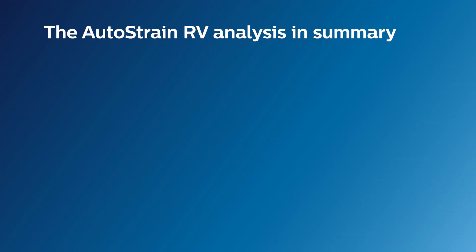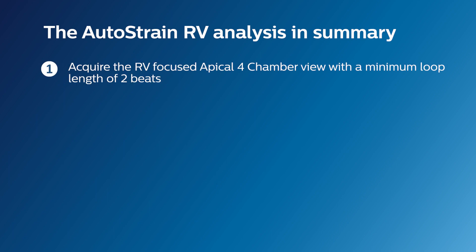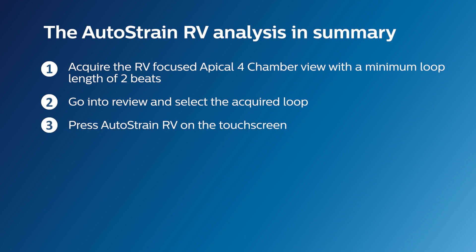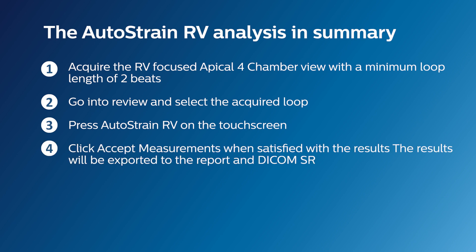To summarize the right ventricle auto strain analysis: acquire the RV-focused apical 4-chamber view with a minimum loop length of 2 beats. Go into review and select the acquired loop, then press Autostrain RV on the touch screen. Click Accept measurements when satisfied with the results. The longitudinal strain results will be exported to the report and DICOM structured report.